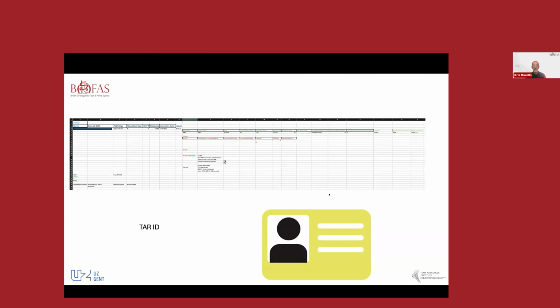I will write down every additional surgery that I want to do, and at the end I will look at what I did in surgery. I write down the implant size and what we actually did in surgery, and then during the follow-up, I will also note the complications or the outcome and the PROMs that I have for this surgery.